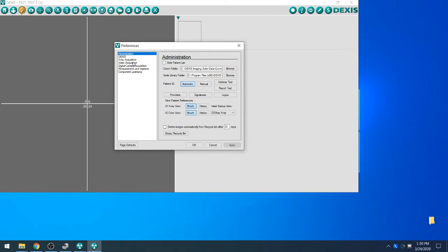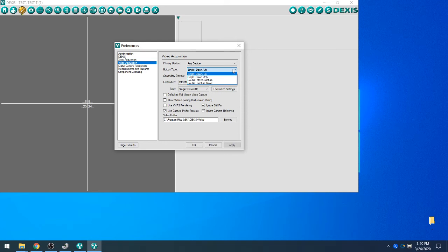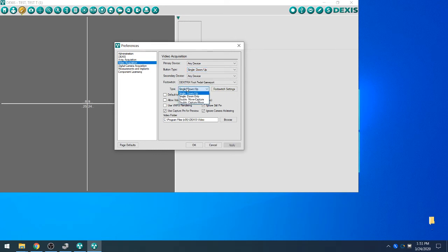From Preferences, we will go to Video Acquisition. These settings are exactly what you would like to see to get the X80 working within DEXIS. One variation being the button type can be changed to Single, Down-Up, or Double Capture Move based on the office's preferences. You would need to match that type to this one here if that one is changed above. Once you confirm that all these settings are the same, go ahead and select Apply and OK.